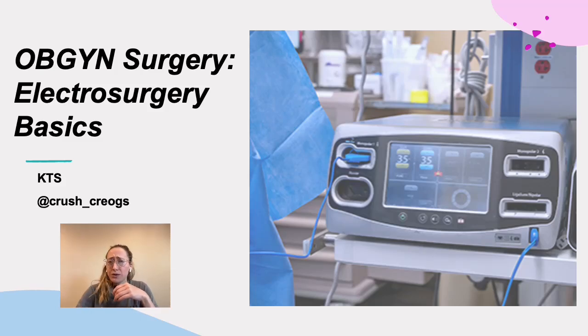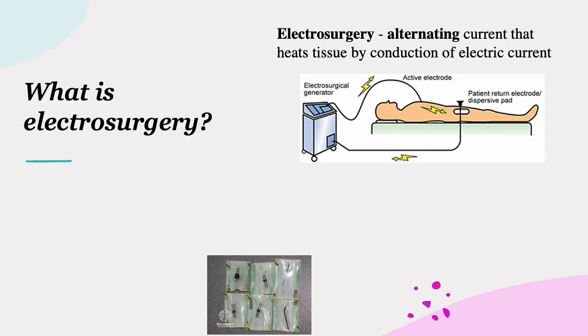Today let's go over electrosurgery basics. So we use electrosurgery in the operating room almost every single operation, and there are a lot of terms that get thrown around that I think get confused. So let's straighten some things out during this lecture. So first, what is electrosurgery?